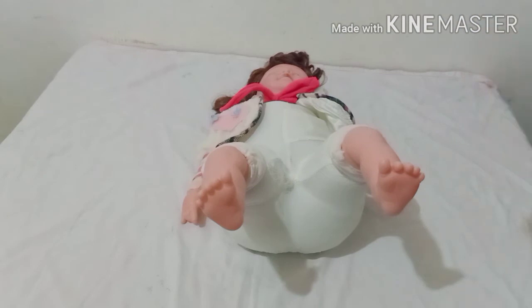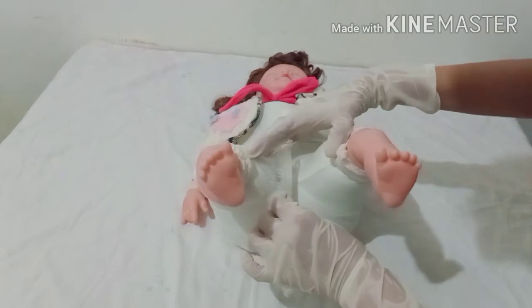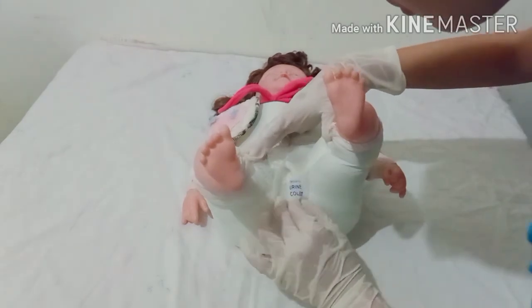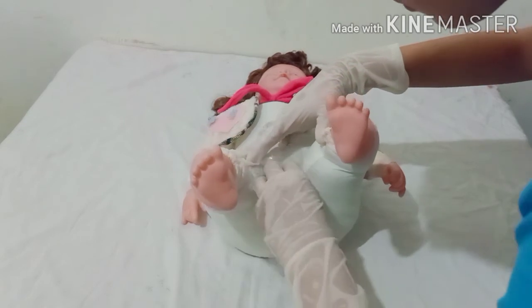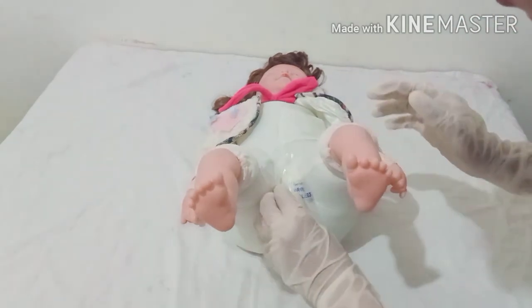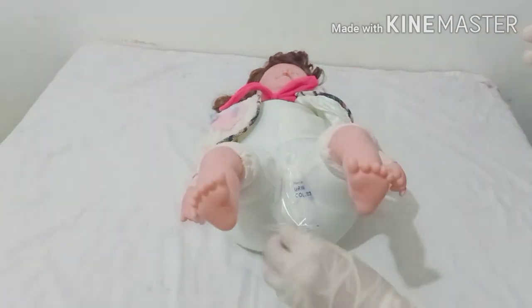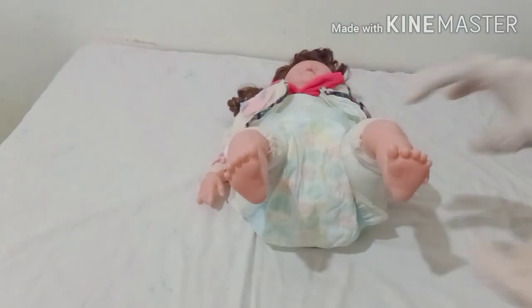For female, fold the wee bag on the midline and make sure that the wee bag is placed exactly on the meatus so that the urine will not leak. And then press adhesive material firmly against the infant's skin, starting from the lower part of the perineal area going up. For male patients, ensure that the penile shaft is in the wee bag. And then make sure when putting on the diaper, it is not too tight to avoid the urine from leaking.